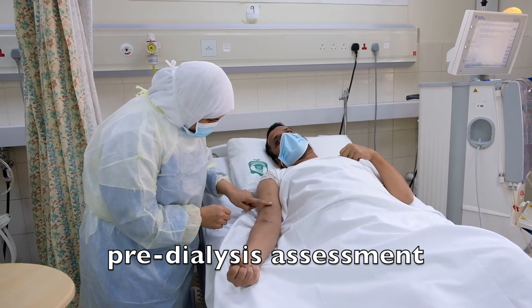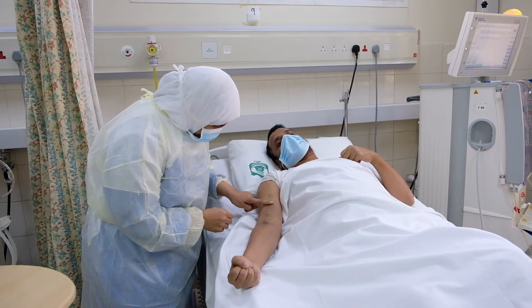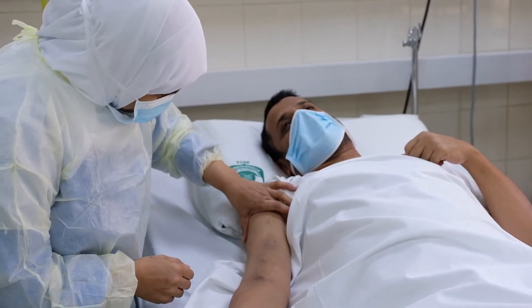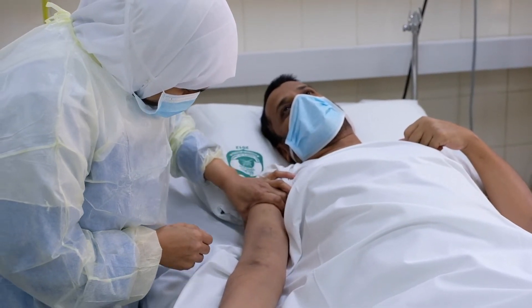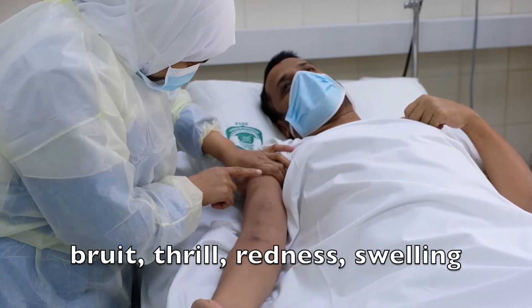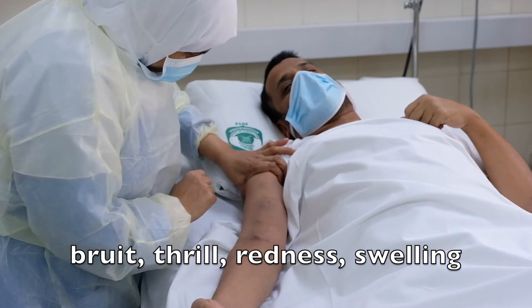Assess the fistula and identify sites of cannulation. Assessment of the fistula is carried out when the patient is in a comfortable position. Identify if any signs and symptoms of infection are present, which must be reported.